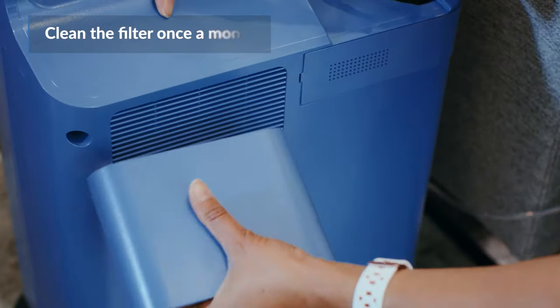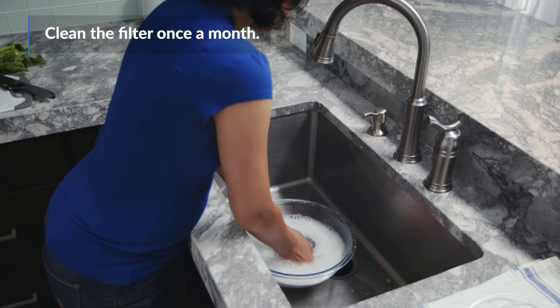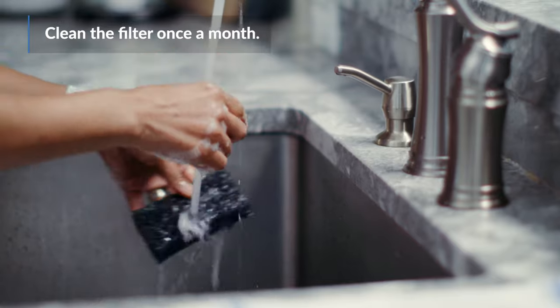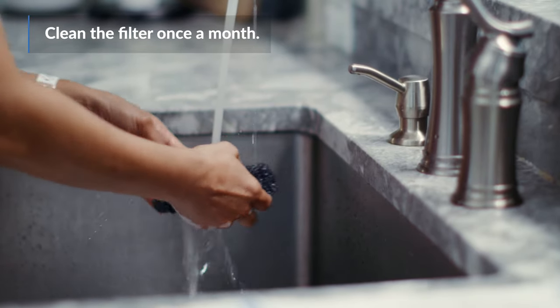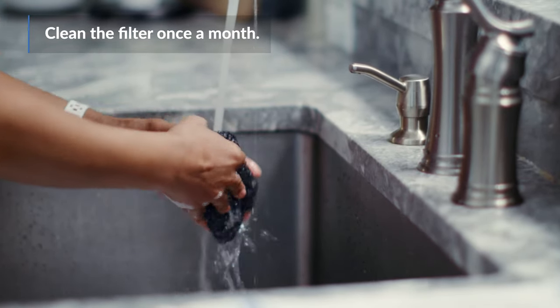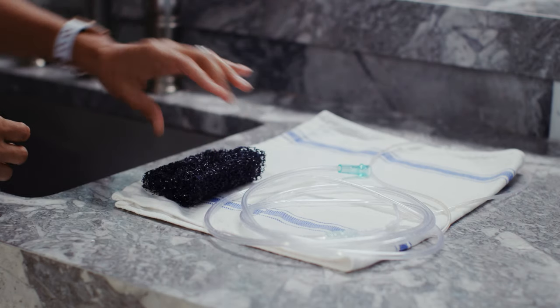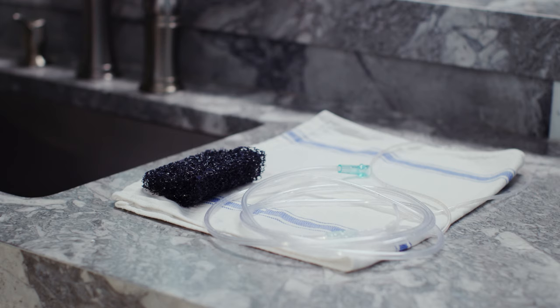Clean the machine's filter once a month by removing the filter and dipping it into a clean container filled with water and mild dish soap. Scrub the filter with a washcloth to remove any small pieces of dirt or dust, and rinse it under water to remove all soap residue. Then set the filter on a clean dry towel and let it air dry completely before putting it back in the machine.